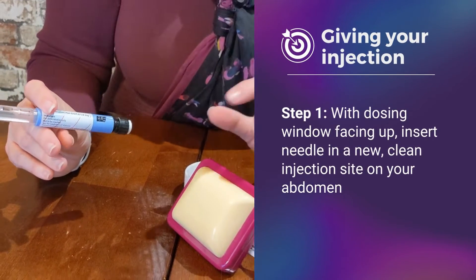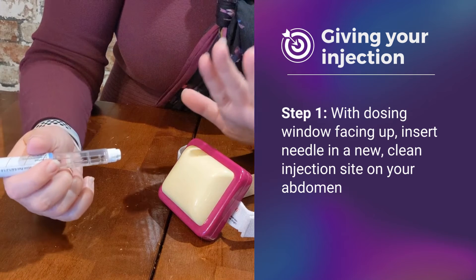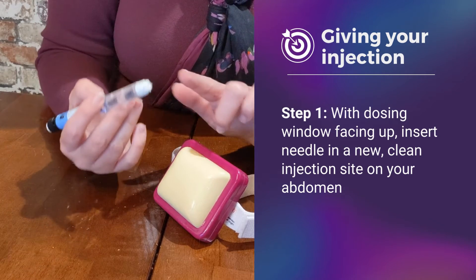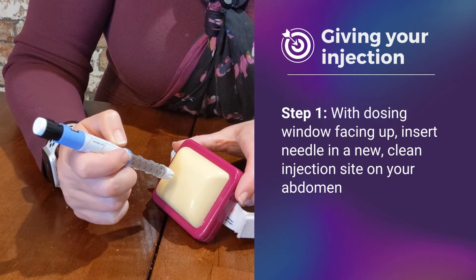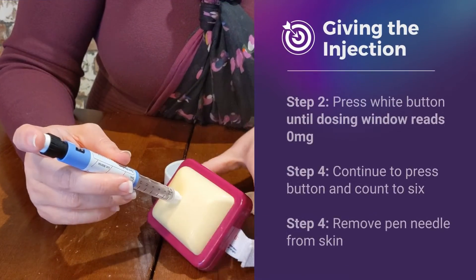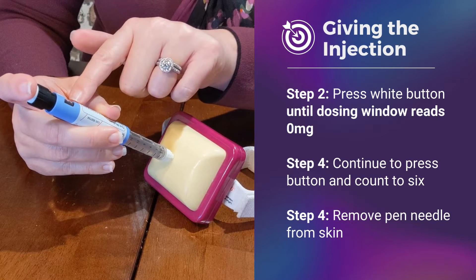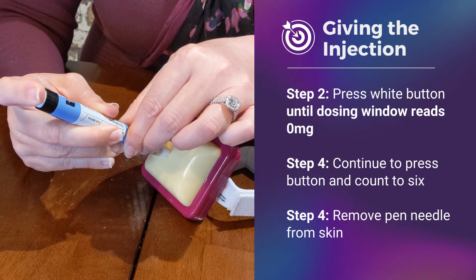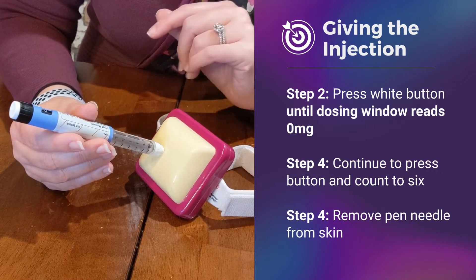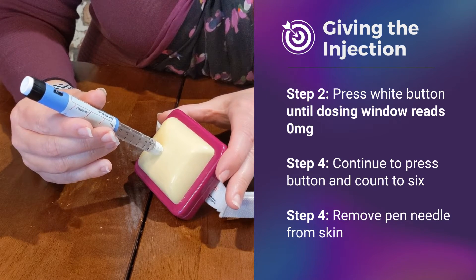We are going to pretend that this little belly is your abdominal area. Remember that you've already dried it off with some alcohol, and you're going to give your injection not within two inches of your belly button. You do not need to pinch your skin — the needle is very small. At a 90-degree angle, inject and make sure that white portion goes directly to the skin. Press this white button, and remember that the dosing window should be facing up so you can see when it moves from your dose down to zero. Once it reaches zero, start to count to six, and after you've counted to six, withdraw the needle.